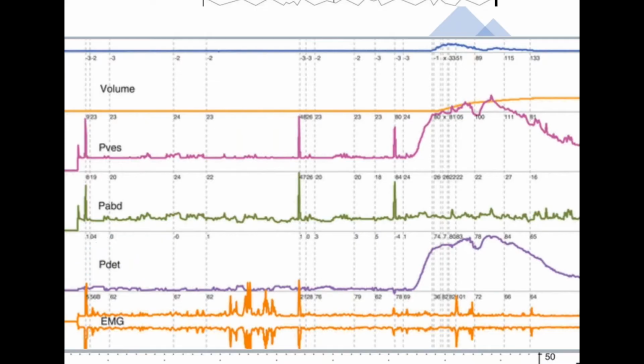If you imagine that I have a normal detrusor muscle and I am coughing now, what will happen in my abdomen? The pressure inside the abdomen will increase. And when I increase the pressure in my abdomen, any organ inside my abdomen will have the same transmitted pressure. The stomach will get this hit, the bowel, the bladder, every organ inside will get this pressure transmitted from the abdominal pressure.